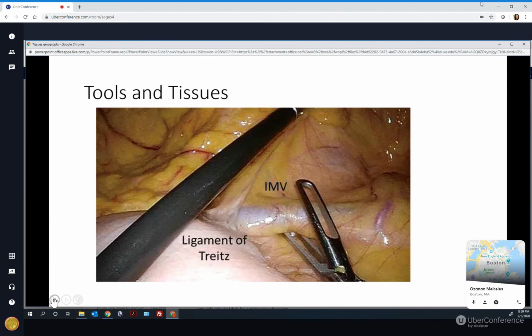And that's the pretext I think we should take as we move forward: every single surgical image we're showing here, there is a patient undergoing surgery with a goal. And therefore, if you see visual cues such as this, we should infer that it's very likely to be this type of operation.